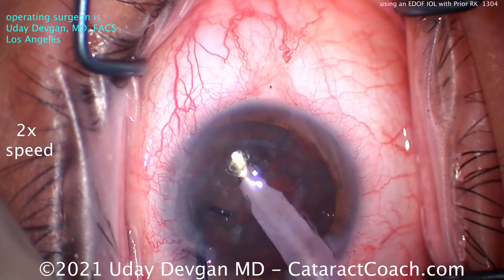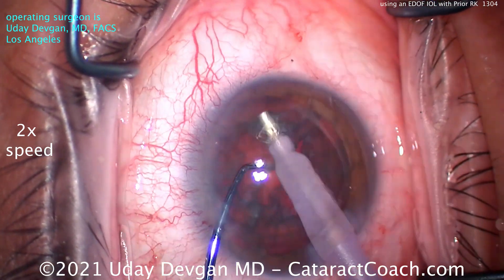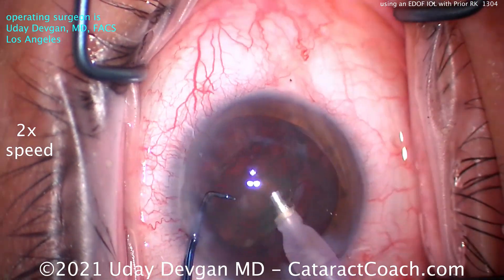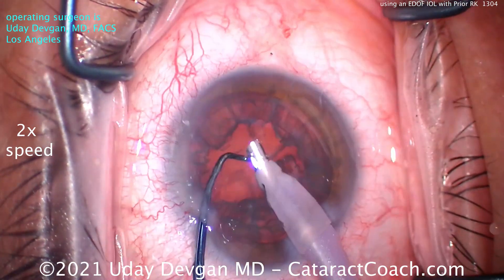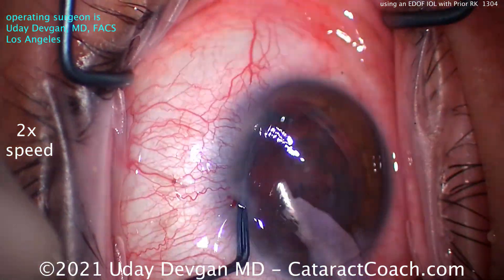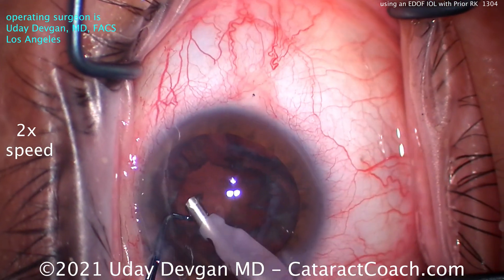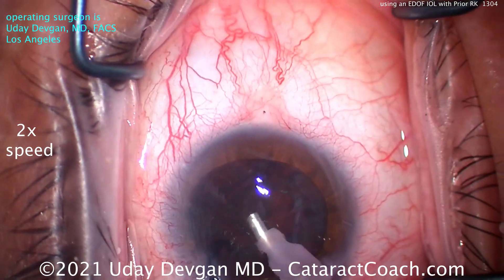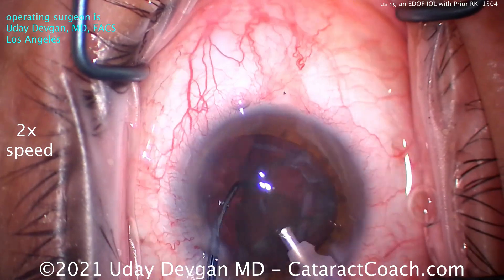Lens calculations are a little more challenging in patients with RK, and it's a lot harder to hit that target because you can't really measure the cornea very accurately. In general, the error in RK is that the machines we use overestimate the corneal power. As a result, we end up choosing a lower power IOL, and that may end up causing the patient to be hyperopic in the post-op period.